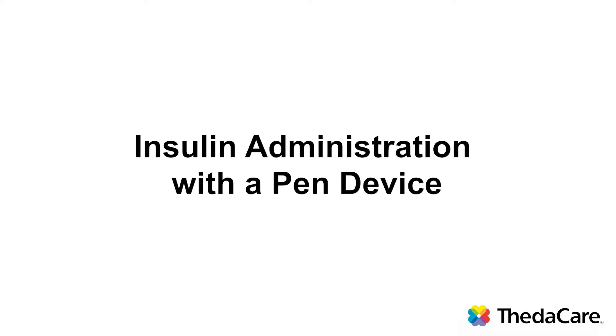Hi, my name is Joyce Graves. I'm a nurse diabetes educator with ThedaCare, and my topic today with this video is how to draw insulin using an insulin pen device.